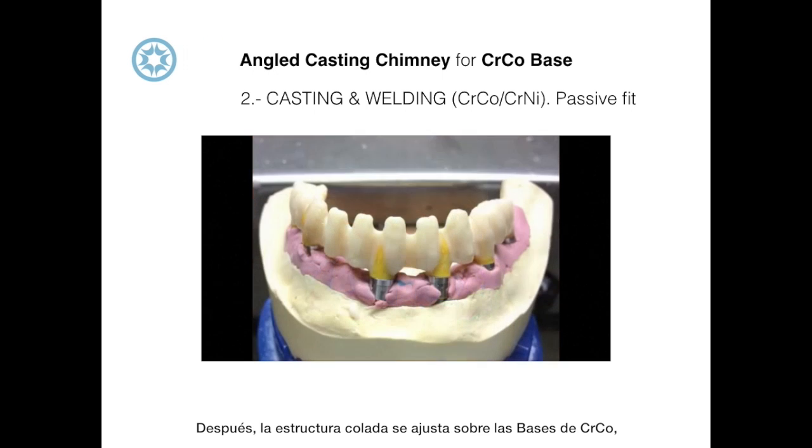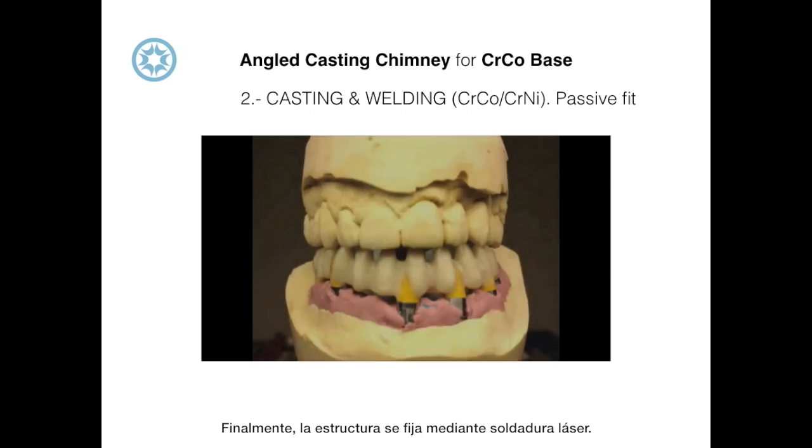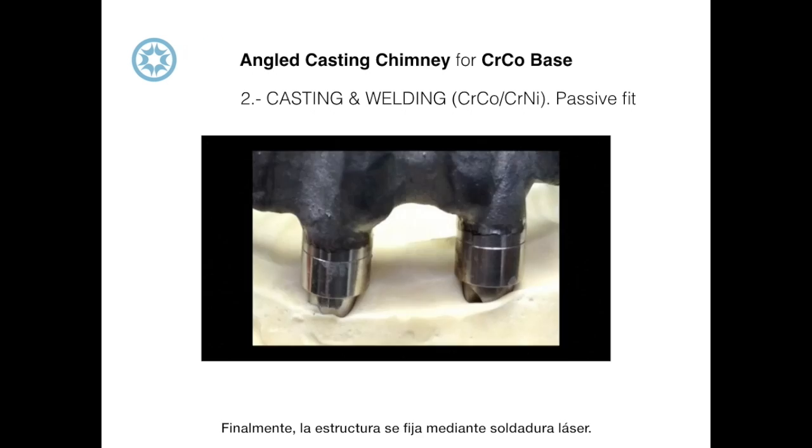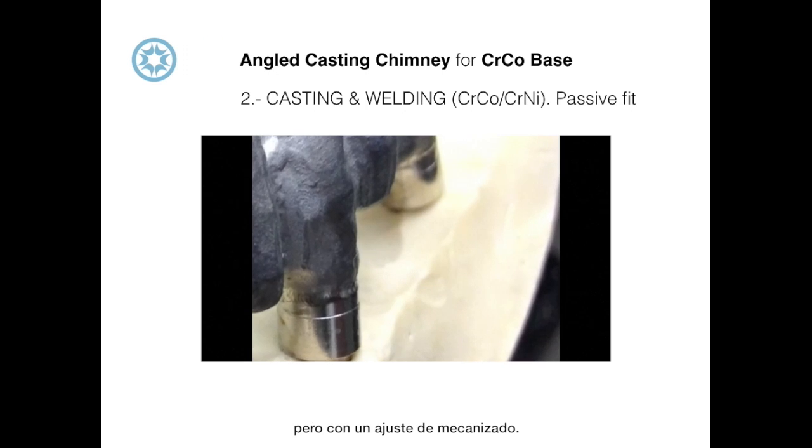After the casted structure is adjusted over the cobalt chromium base, thereby achieving a passive fit, the structure is fixed through laser welding. In this case we have a casted structure which is quite affordable but was made using a mechanized fitting.